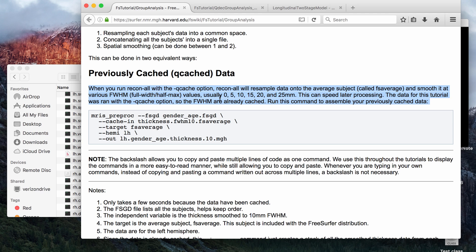Basically, if you're going to have any type of control group where you're looking at surface data or you want to make surface maps, then you're going to have to smooth the data because every brain is different. Everyone uses some level of smoothing. I usually use 10 millimeters and the smoothing helps eliminate or minimize the effects of normal variation within brains.